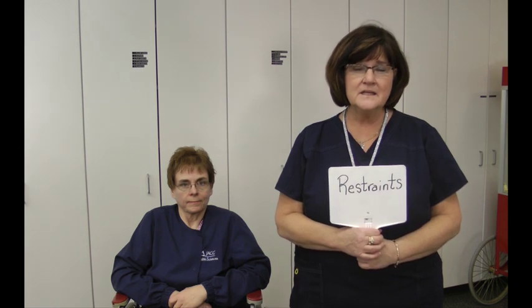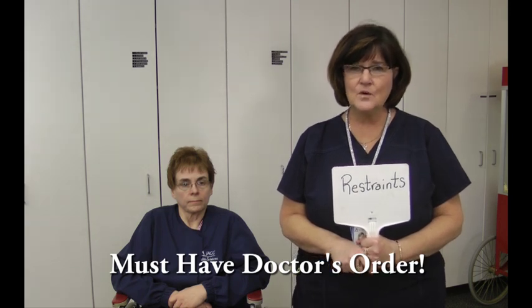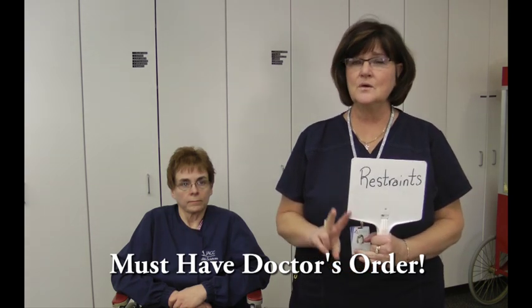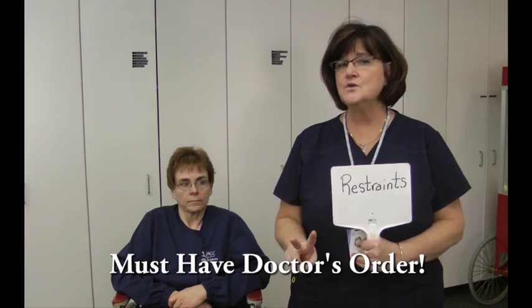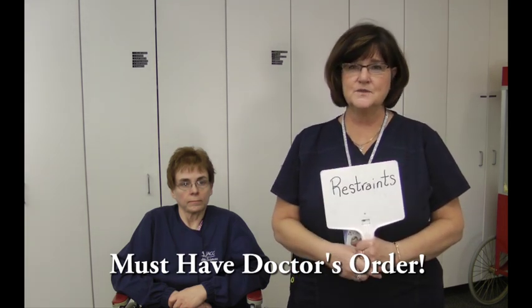Today we're going to learn about restraints. I want you to know that restraints are illegal in the nursing home unless a doctor orders them. They can only be used for the protection of the resident, them hurting themselves or them hurting someone else. Again, restraints cannot be applied unless a doctor specifically orders them, and there's usually only two kinds of restraints that we can use. One is called a waist restraint and one is called a vest restraint.